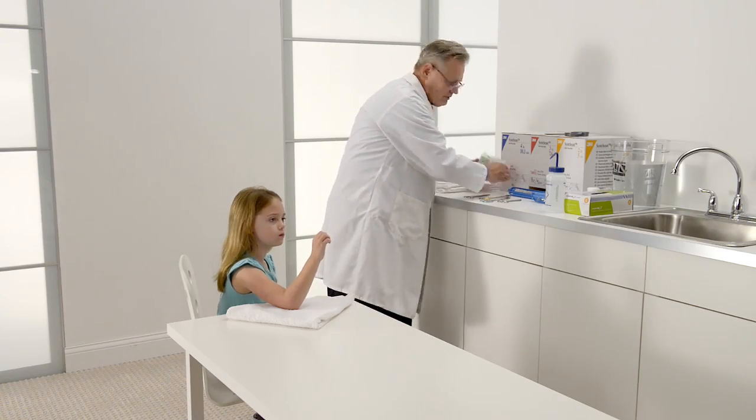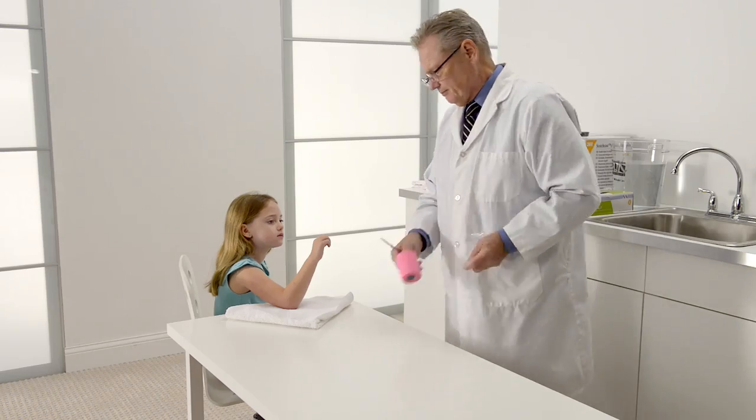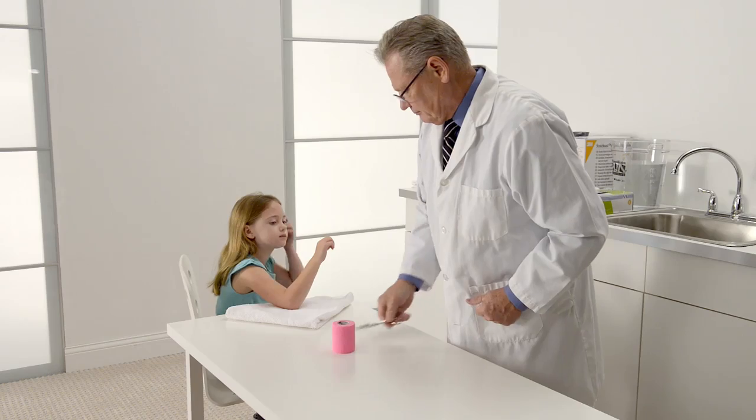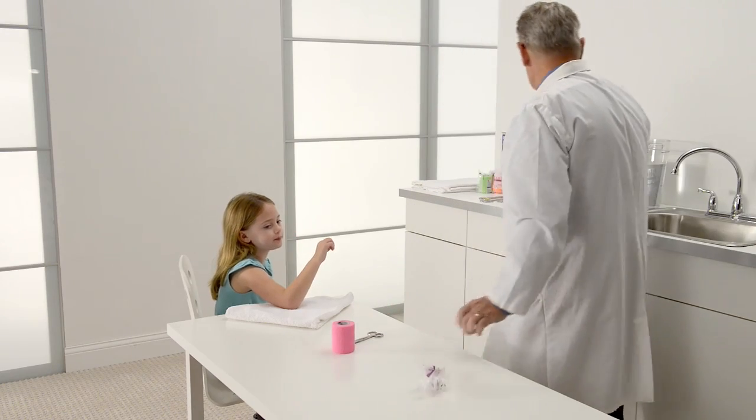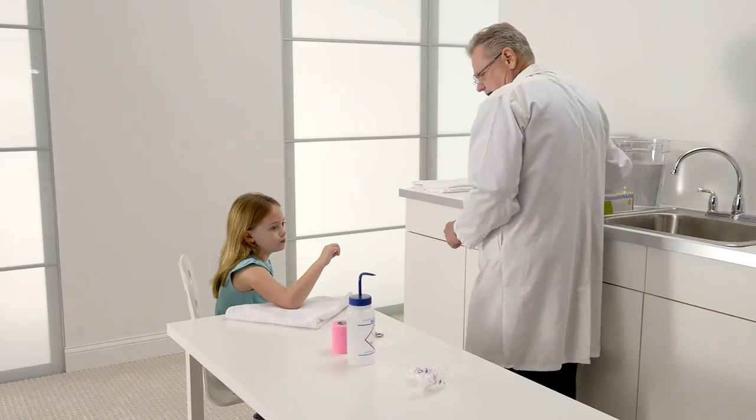Potentially constrictive materials, such as stockinette, should be avoided for this procedure. Cast padding may be applied to the extremity to meet treatment goals, or if it's a fresh fracture, to accommodate anticipated swelling. Let's get started.